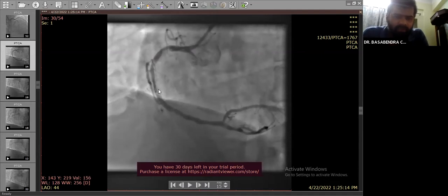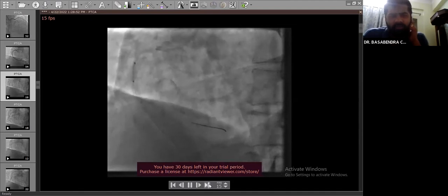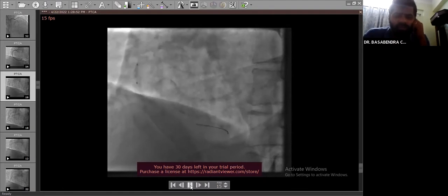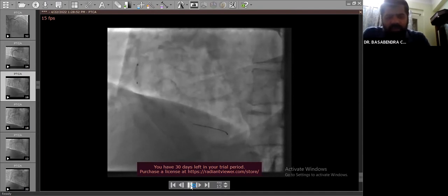The tightest part was in the mid part and just at the junction of the mid to distal part, but there was a patent channel, so we thought that we should take a Runthrough Extra Floppy wire, and it would not be a problem to negotiate to the lesion part in the distal RCA. So wiring was not a problem. However, first we took a 2x10 semi-compliant balloon, which went up till the mid part, but we could not cross the distal most lesion. It was not going, so we decided to dilate the mid and proximal part and come out.